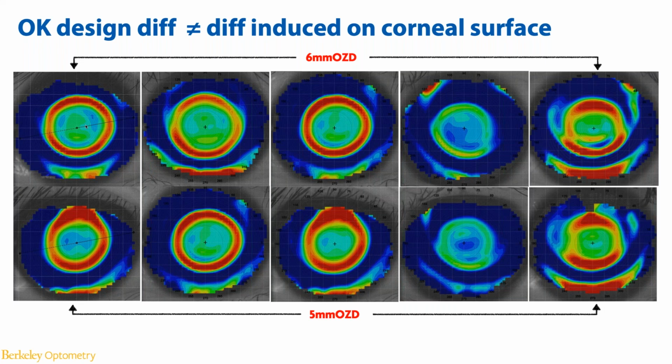So I think that concludes our questions for this evening, unless we have any others that are coming in. It seems like somebody just wants to confirm that the advantage of the 5mm lens design is that it's a faster treatment and more paracentral steepening, although it's difficult to actually measure that magnitude. Is that accurate? Correct, based on this really small study. So I'm hoping to learn better with the actual application of these lenses in a real clinical population.